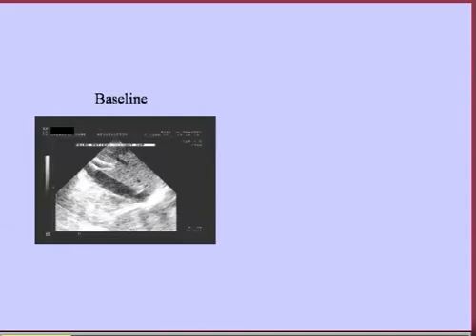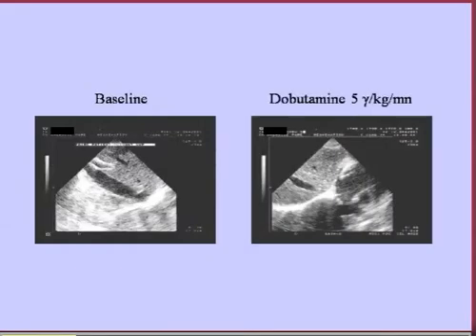And look at now the IVC. The IVC was very congestive because this patient had a right ventricular dysfunction related to the septic process. And so in this situation, it's very easy to know that the right treatment is probably to give dobutamine, and indeed a few hours later the clinical situation was much better. And look at now the IVC diameter. The IVC diameter was significantly decreased, only reflecting the improvement in right ventricular function.